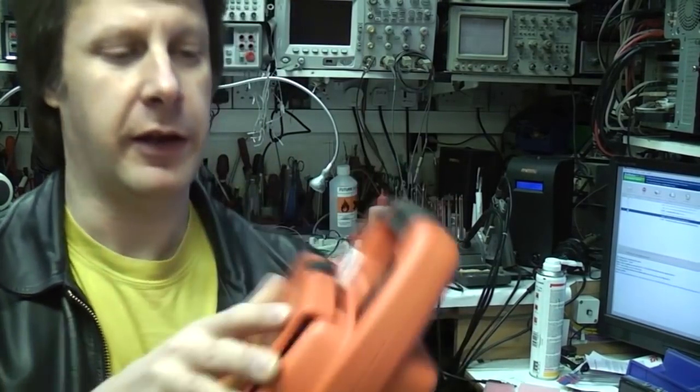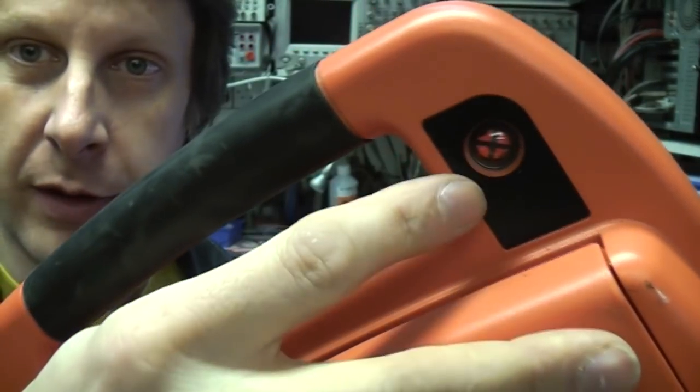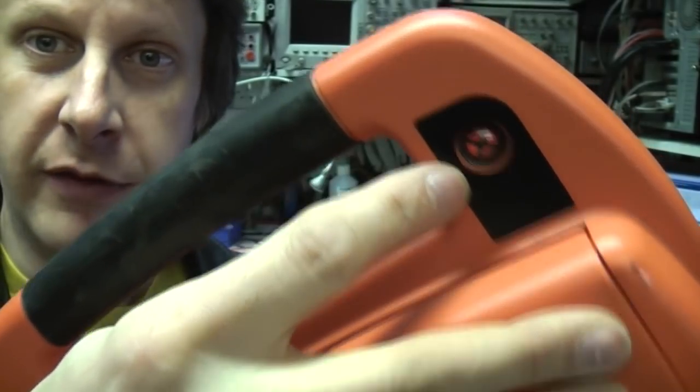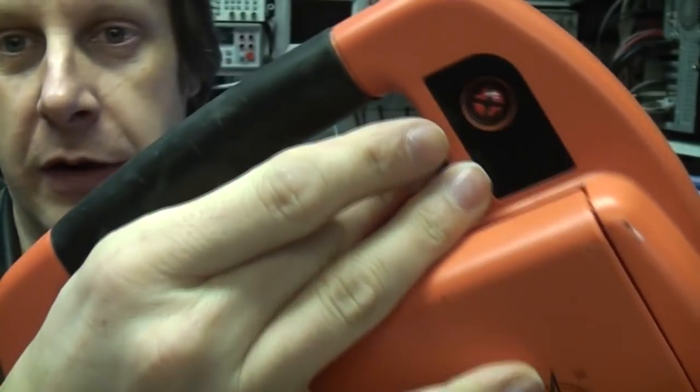One interesting thing is on the front, this indicator, this is like a flip-dot indicator. We'll pull that apart and operate it later but this gives an immediate indication that there's something wrong so it's red with a cross through it and this flips to green when it's okay.